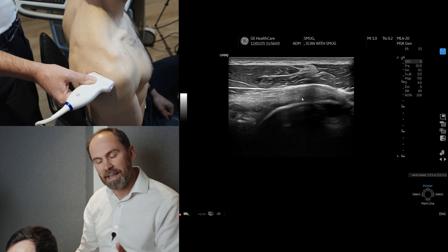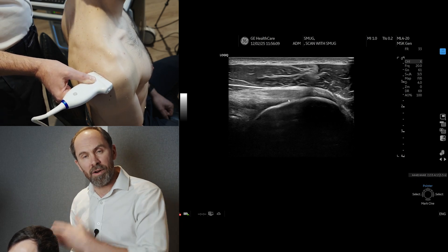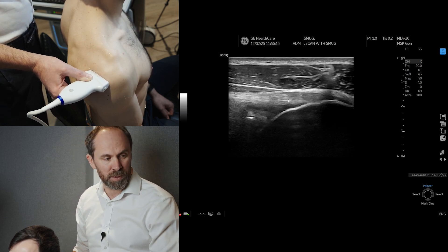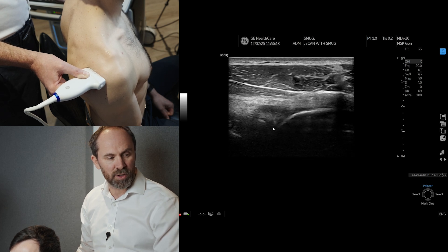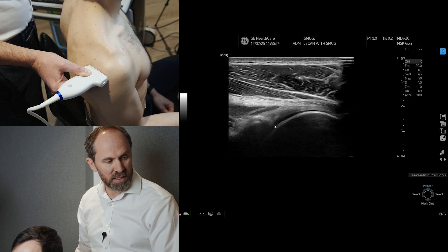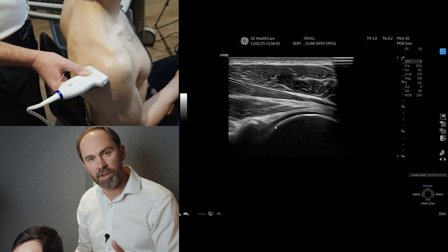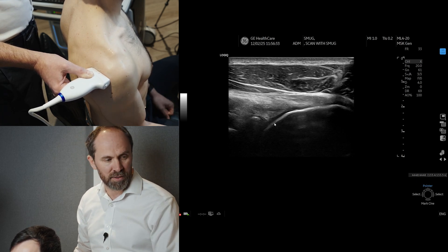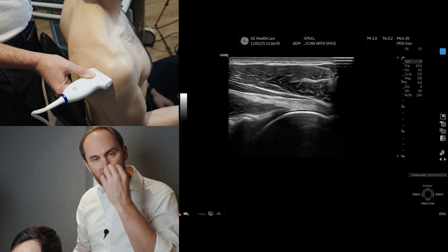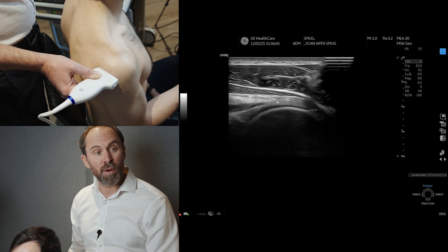By getting the patient to laterally rotate, it actually means that the infraspinatus becomes parallel to the probe, and therefore the sound beam is perpendicular — we avoid anisotropy. Can you see that lovely image there? We can then have a look at the joint. If we just rotate the hand in and then out, we can see if there's any fluid coming out of this posterior joint recess. This is also where we would target a glenohumeral joint injection under ultrasound guidance. You must look at infraspinatus in transverse and long, and I would advise starting in neutral and going into lateral rotation.